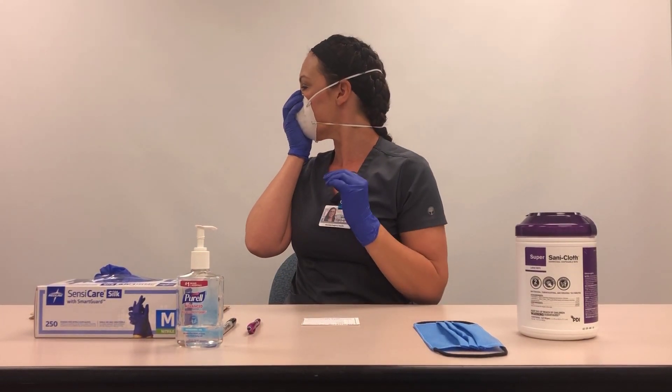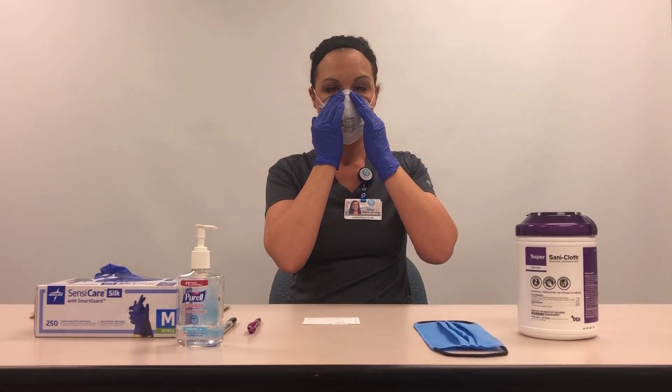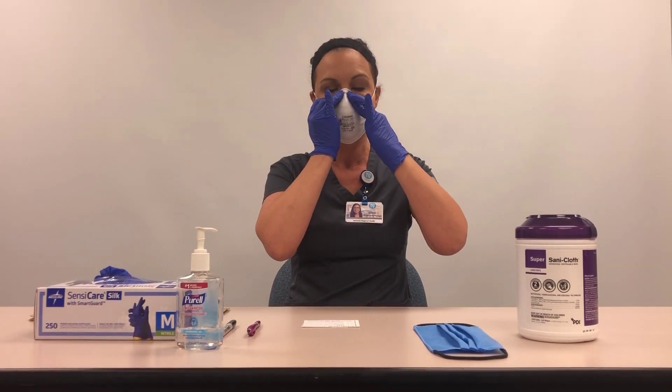Do not criss-cross the straps. Press the fingertips from both hands on either side of the metal nose clip to mold the respirator to the shape of the nose.